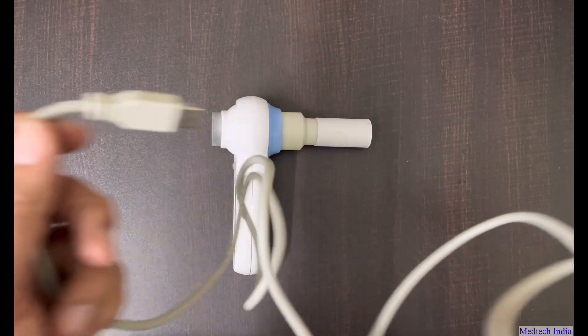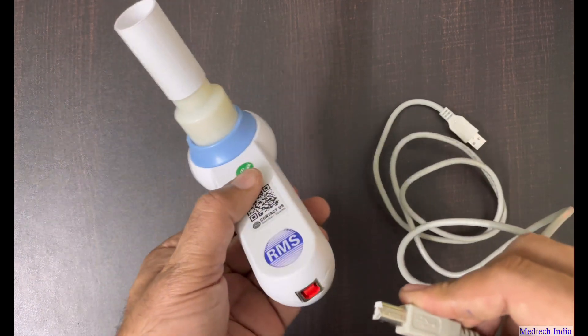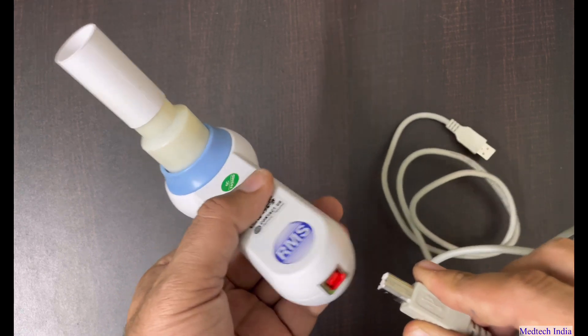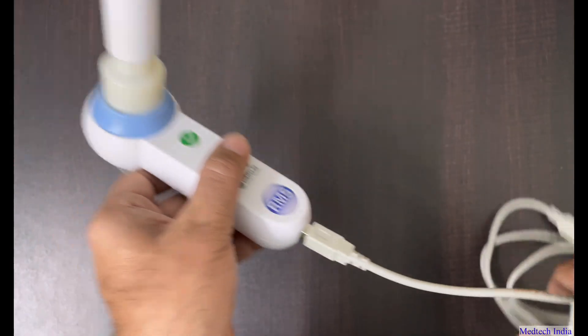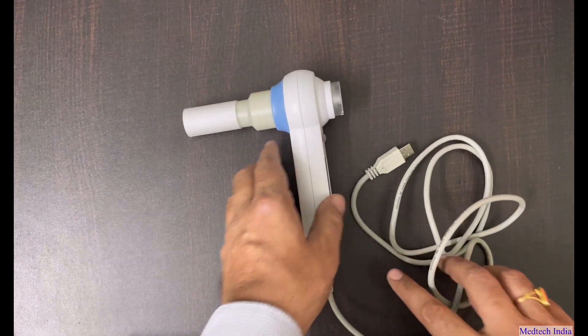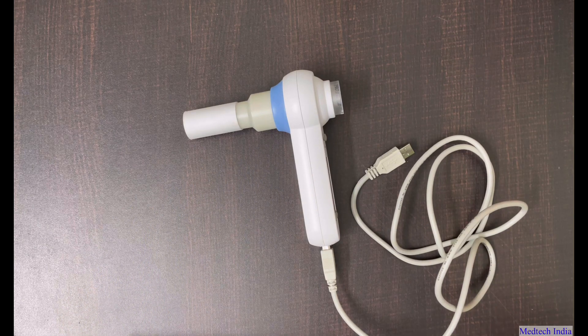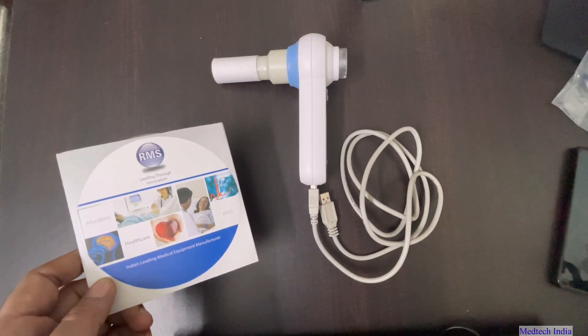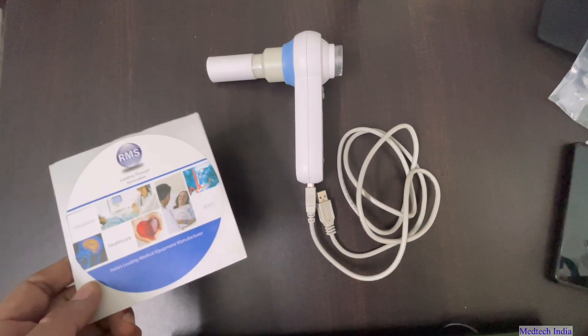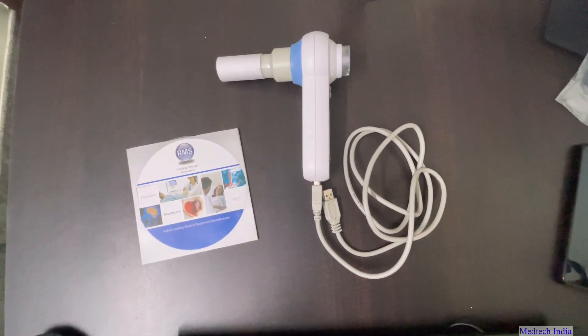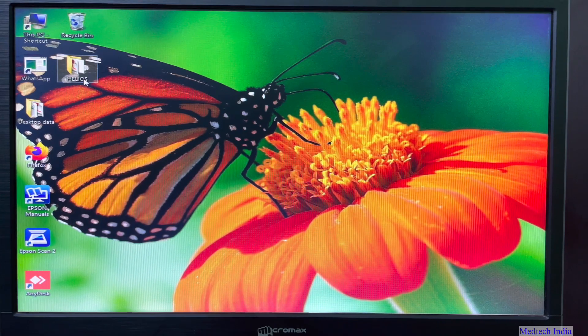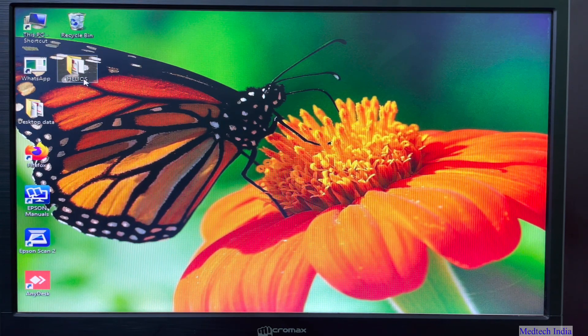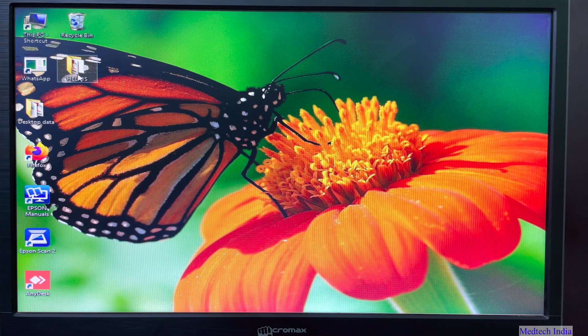Our next step is to connect the handset to computer through USB cable. As you can see in video, we are connecting one part of USB cable to handset and other part of USB cable will be connected to our computer or laptop USB port. Now please copy the data from given CD on your computer desktop. Now you can see here we have copied the data from CD. Helios folder has been created. Let us start software installation now.